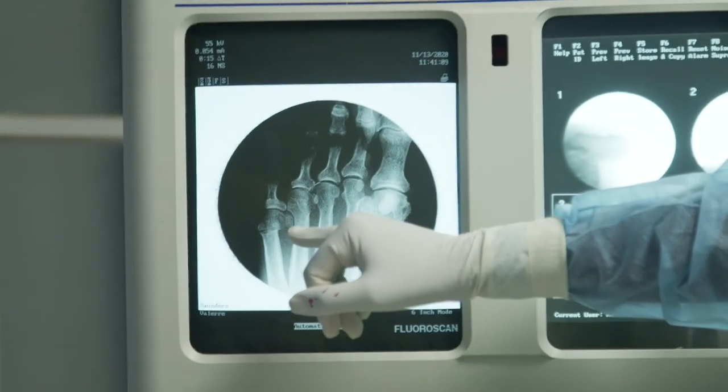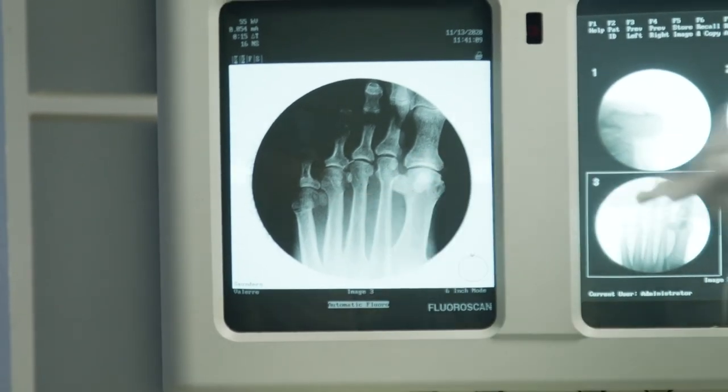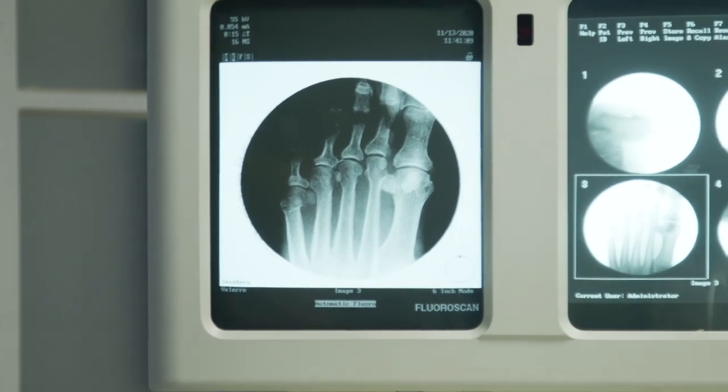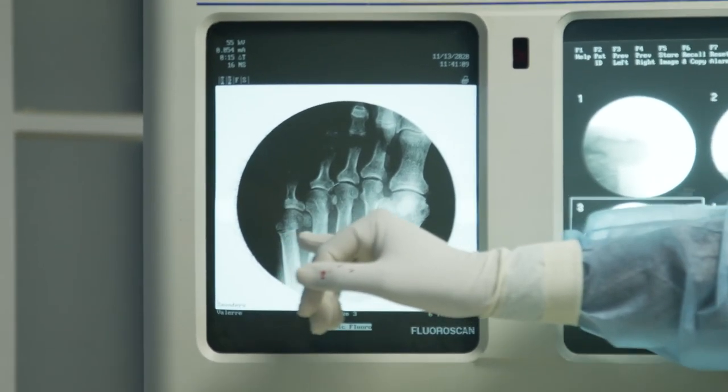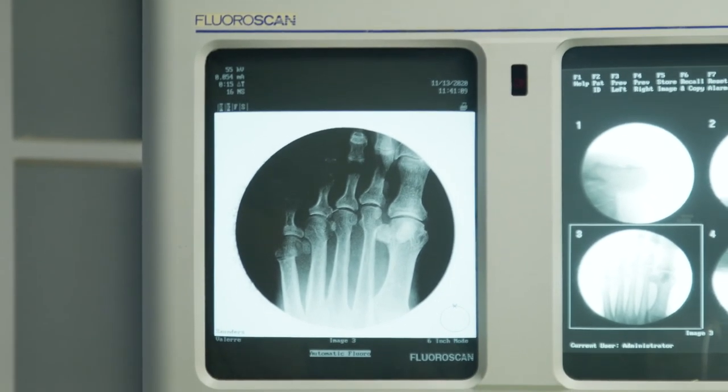Jamming. So you can see now the line straight across there. You see that? Come around, doctor. So you can see that. Fifth metatarsal head. See the line? That's our osteotomy through and through. See it, Raleigh? Bam. We jamming, brother. Let's stitch. Put you in a shoe. You're out of here. Wasn't that good?